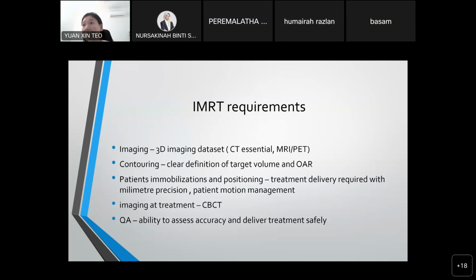So for this pelvis case, they may use a body mold. A body mold is where we let patients lie on special cushions. Then we will vacuum the cushions according to the patient's body. This can make sure every day they reproduce the same position during their treatments.